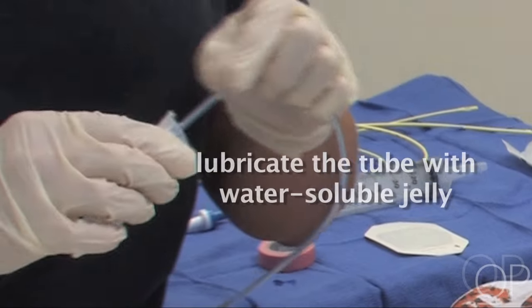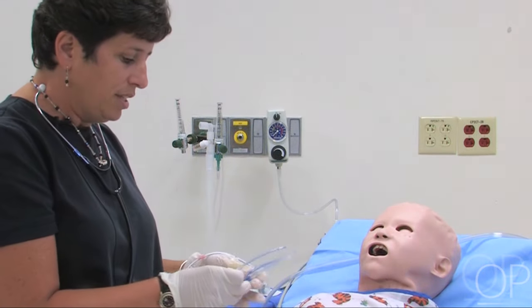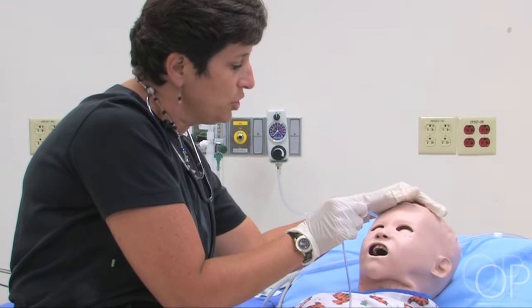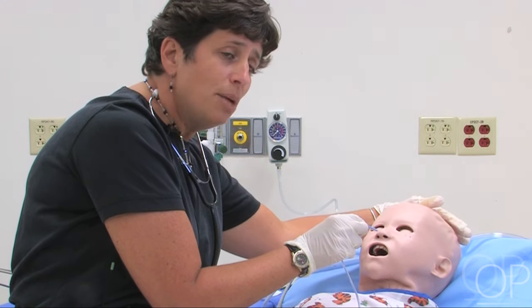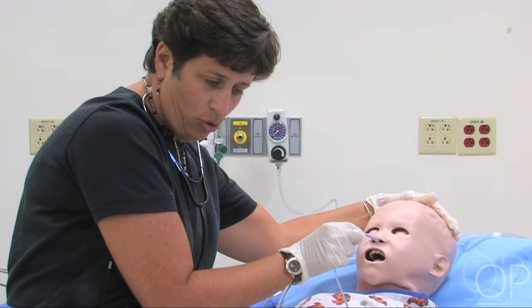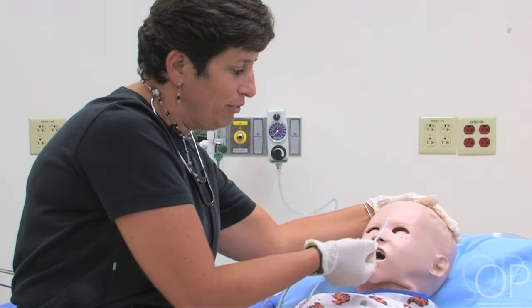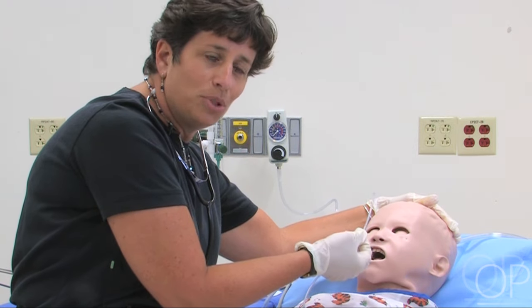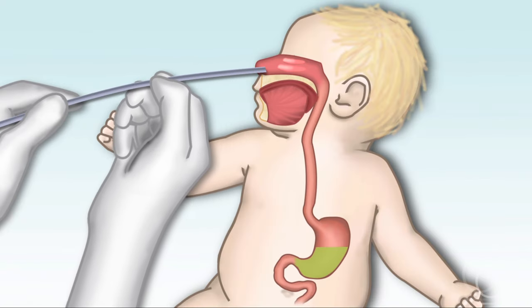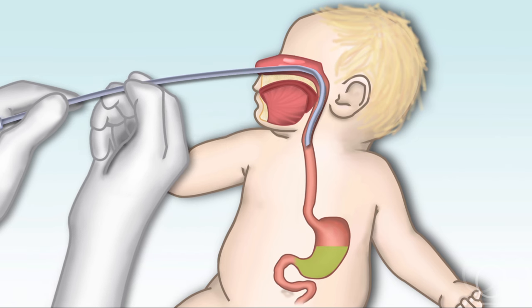You want to lubricate your tube with some water-soluble jelly. Now I've prepared my patient and he's ready to have his tube put in. When you're putting the tube in, it sometimes helps if the patient is awake to have them bring their chin to their chest a little bit — that helps the tube go down. When you enter the tube into the nose, you want to go back and down, because if you go up you could head towards the brain instead of down to the stomach. This is the time to ask the patient to swallow, if they can, and continue to advance your tube.